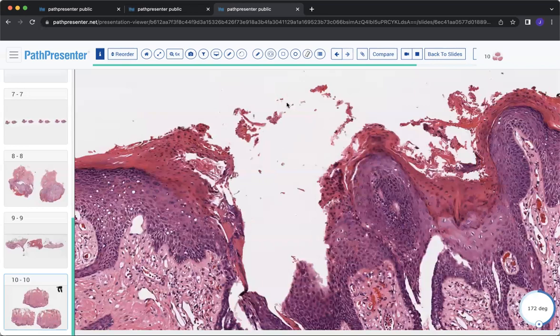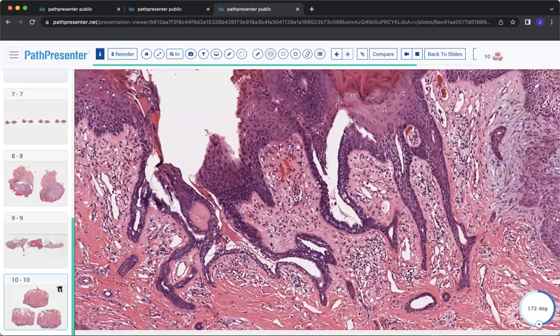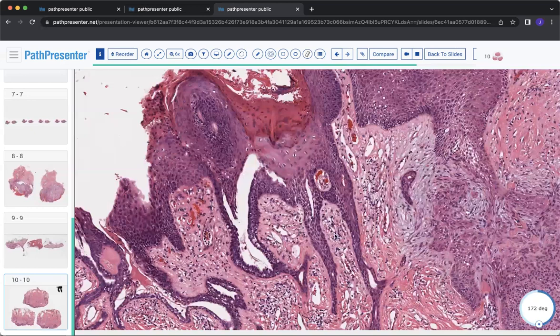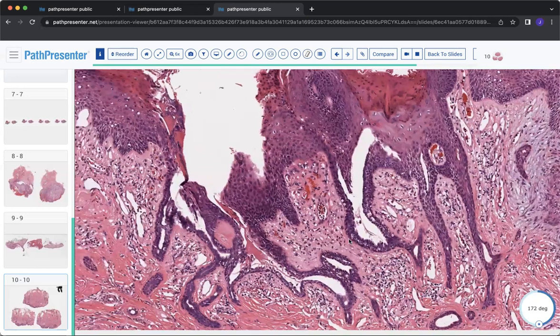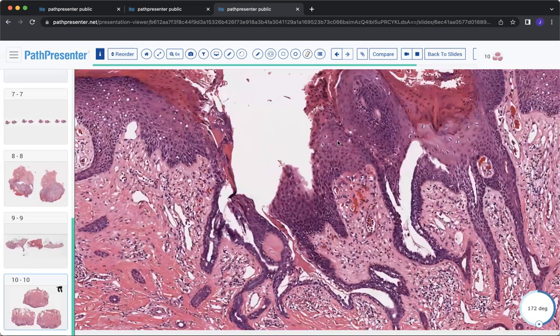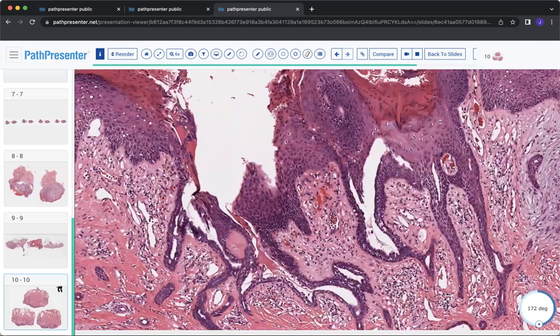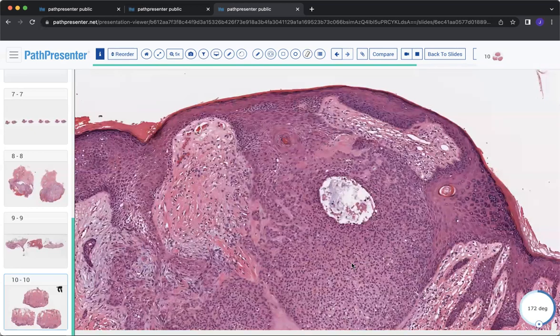So this was actually thought to be a small syringocystadenoma papilliferum, which is another entity I'll mention in my other videos, but it's definitely in your adnexal chapters, and you should know about it. There's never a good time to start knowing about it because it's going to be something that they could easily test you on, and you'll see plenty in real life, whether you're in clinical practice or dermpath practice or both. So this is a small little syringocystadenoma papilliferum, or SCAP, as many people call it for short, just because it's much quicker to say it that way, but developing right next to a trichilemmoma.